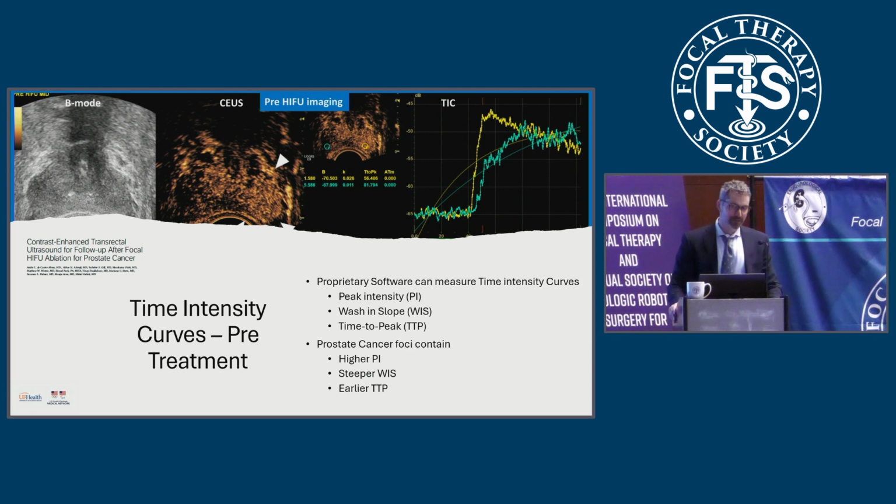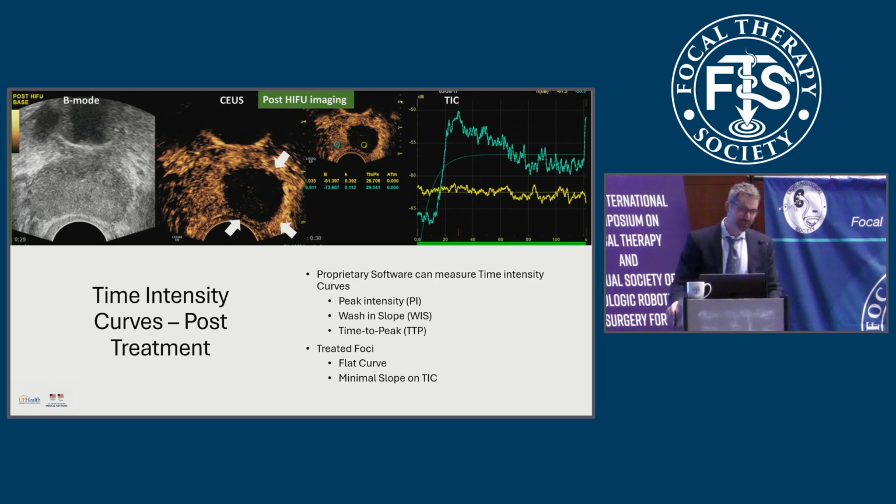And we've been talking about recurrences happening at margins, whether that's significant or not. Well, this is real-time assessment of where your margin starts and stops. But you can take this one step further, and once you've treated, you're still in the OR. We're not talking about 3 months later, 6 months later. You can then slide your curves to margins and look, well, do I now have a flat curve? Do I have minimal slope? Or is it still rising? And so, I don't know if people have done this study looking at margins yet, but this is how I would utilize it.